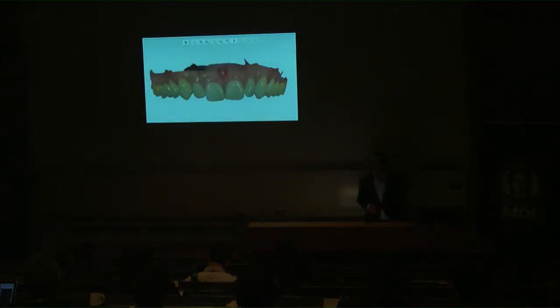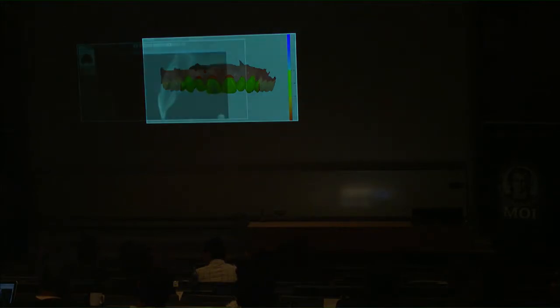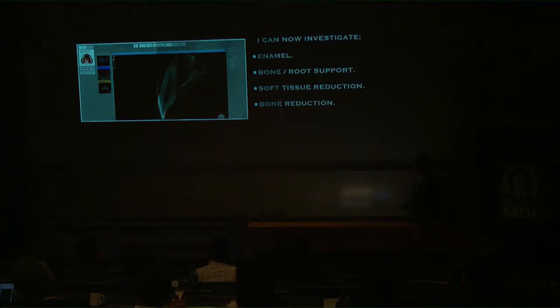So it all starts with a Trios surface scan. This is paired with the CBCT and included in the 3Shape Implant Studio software. We control that the pairing is correct. And then we can start our measurements. Tooth by tooth, we can now measure.